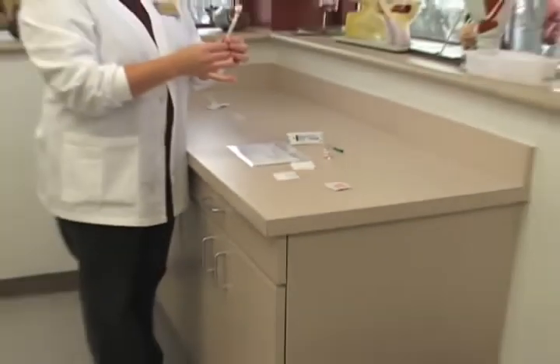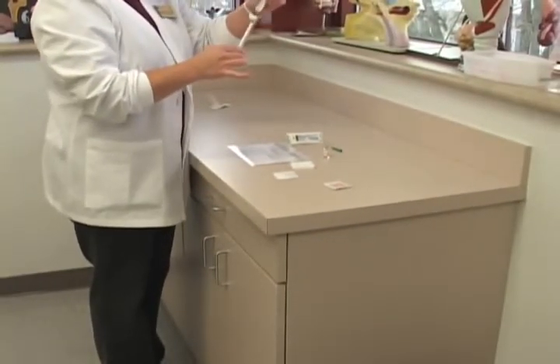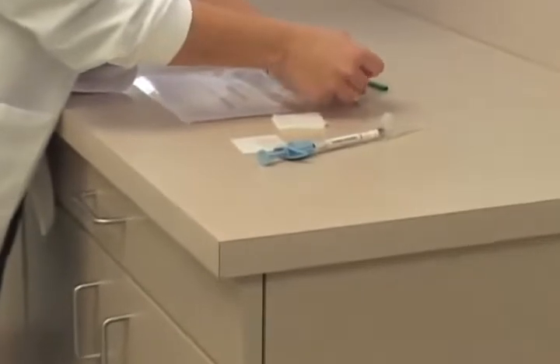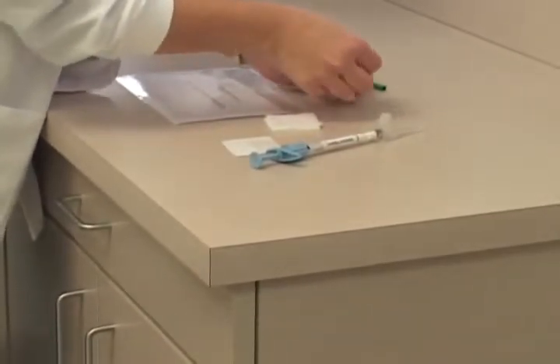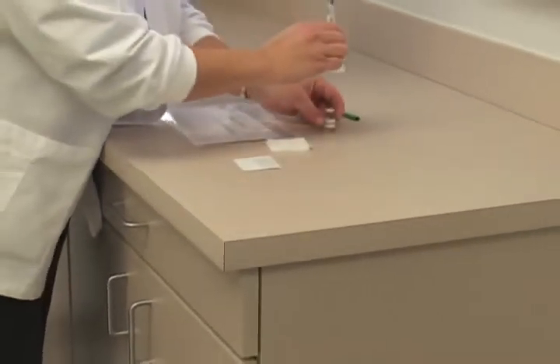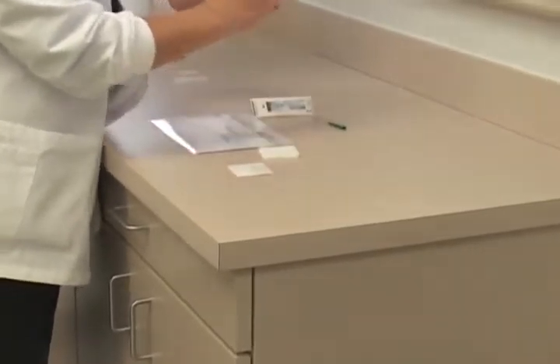When adding a medication to the Carpujet from a unit dose vial, for example atropine, clean the rubber top of the vial with alcohol wipe. And draw up correct dosage of medication ordered. There is no need to add air to a unit dose vial.